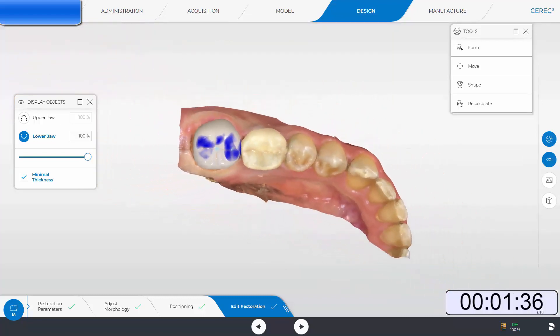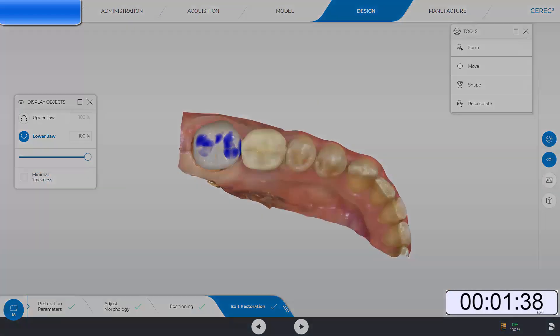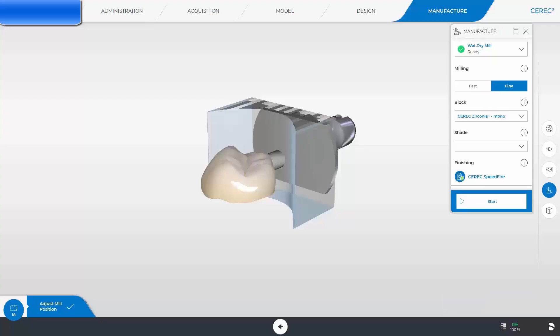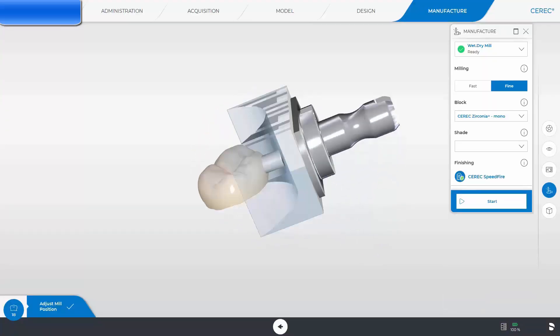This is essentially what PrimeScan and CEREC-5 is all about: efficient and accurate chairside dentistry. One minute and 42 seconds from start to finish.